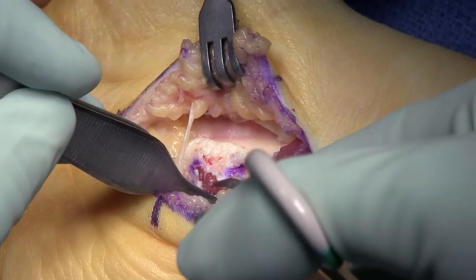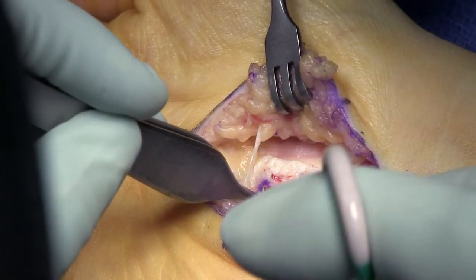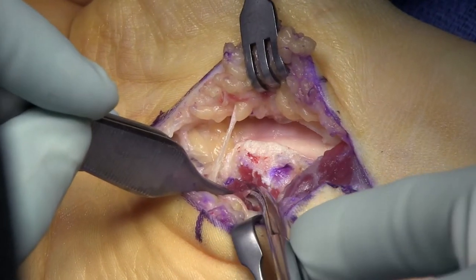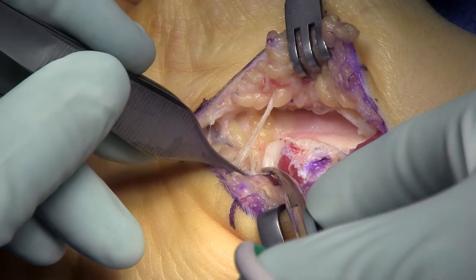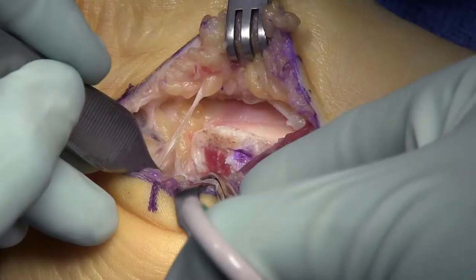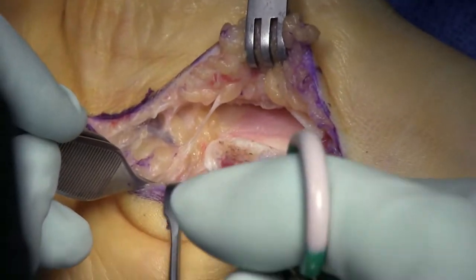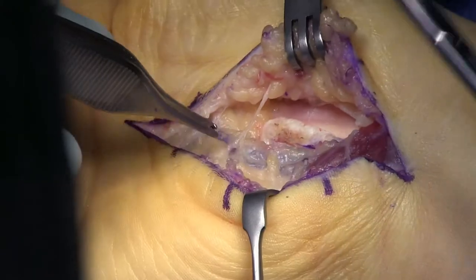I'm going to be putting my cross grafts from the ulnar nerve to the median nerve exactly in this area, so I'm definitely going to decompress the deep motor branch. I think we underestimate superimposed nerve compression in extremity traumas where there are multiple surgeries and secondary compression from swelling. Another slow-down moment: go very slowly as you're releasing the deep motor branch around the hook of the hamate. There are little vessels on either side of the deep motor branch — you don't want to injure them and then have to buzz for hemostasis close to the deep motor branch. We have other videos that show the decompression of the deep motor branch in more detail.